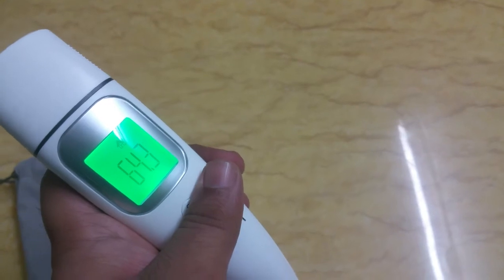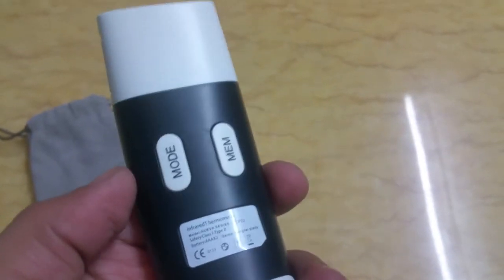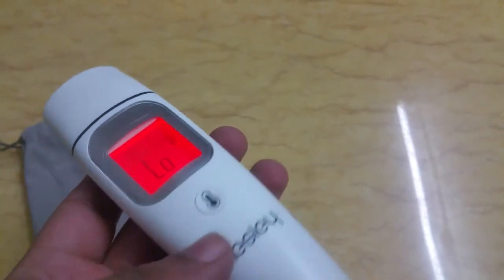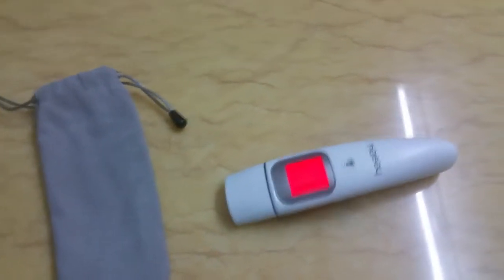The room temperature reads 64.3° — pretty cold inside. Second is the memory button: clicking on it will show you 35 sets of memory. It has 35 sets of readings recorded for better tracking of changes in body temperature or whatever temperature you are recording.